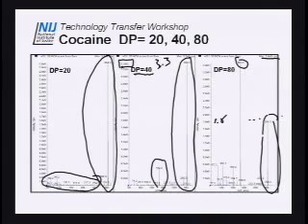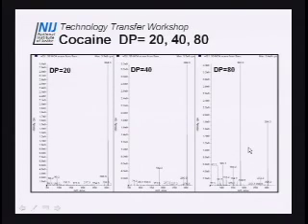And you can now see there's a 105, there's an 82, there's a 150, there's a 272 underneath my mouse button there. Let me clear that up a little bit. You can see here's a, oh dear, there's a 272 right there. This is starting to look like the cocaine mass spec that I expect in full scan. This is sort of in-source collision dissociation right here. If you're using LCMS, this is probably what you're using.